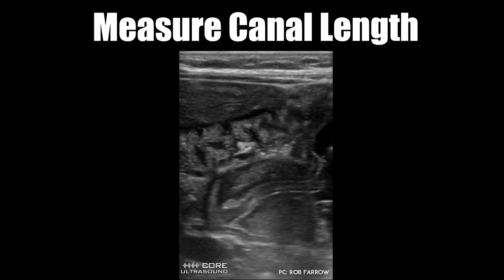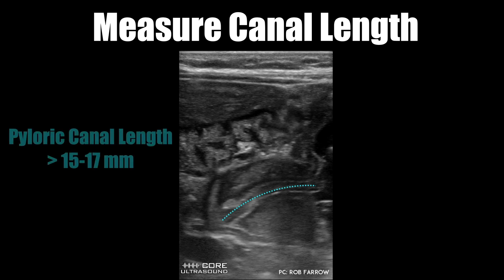The final measurement is the canal length. This will be taken in a long axis view, again shown by the dotted line. An abnormal canal length is anything over 15 to 17 millimeters, and we can remember this range by keeping in mind 16 millimeters and our mnemonic of pi.